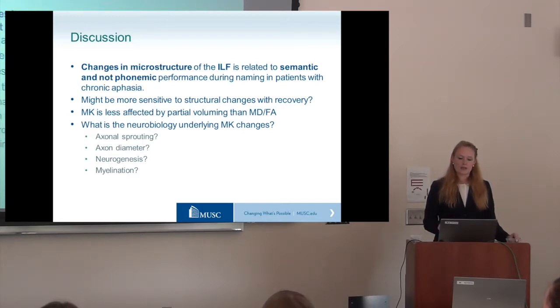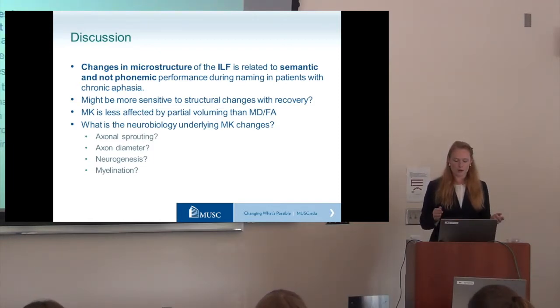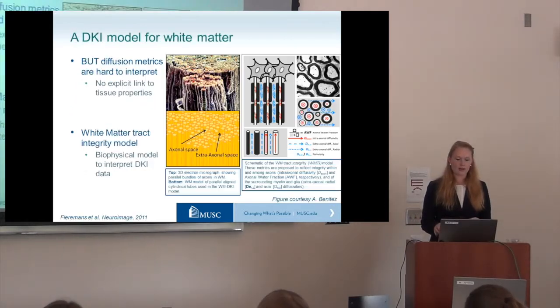I do want to stress that once you start using biophysical models, you have to start with assumptions of what neurons might look like, or how you can describe this environment with some simplified mathematics. Everything I've talked about so far is basically just physical measurements, with very little assumption, but going forward we're making assumptions, and I'll show you here.